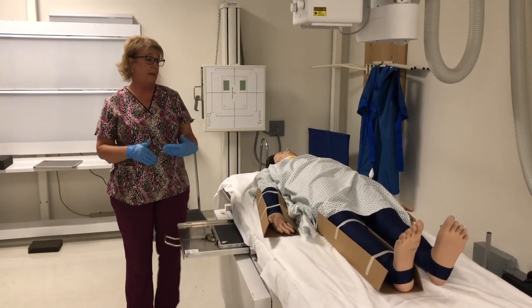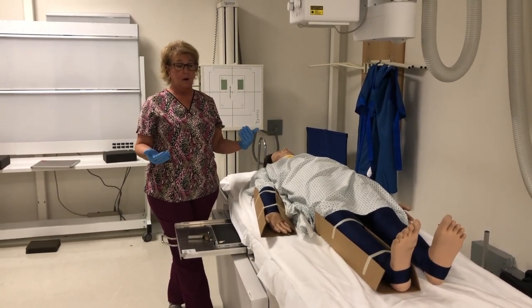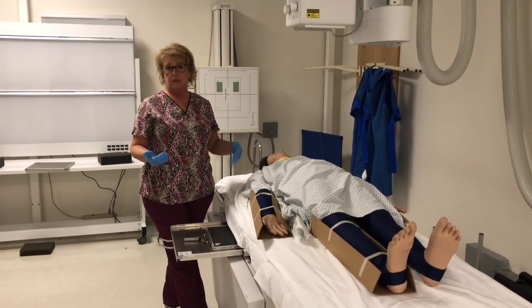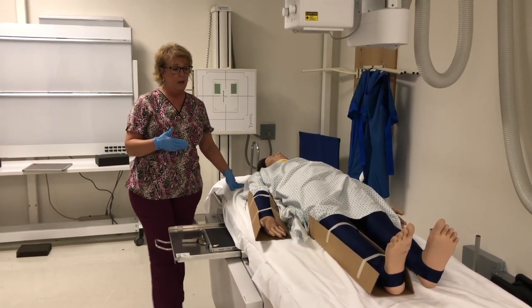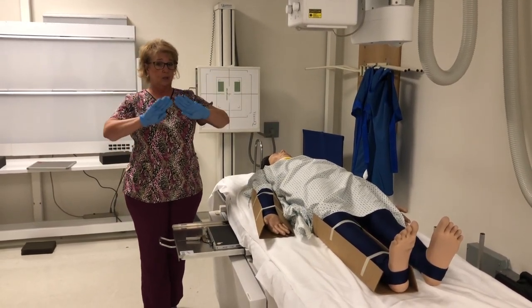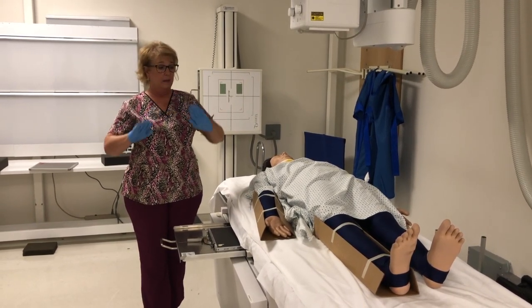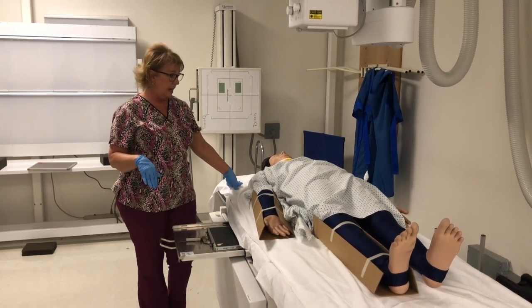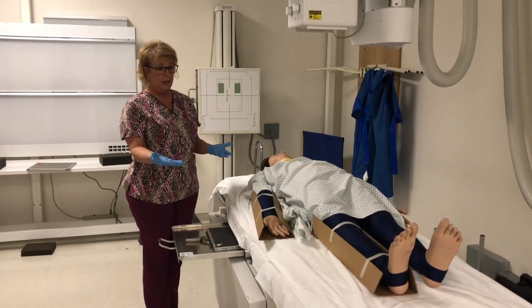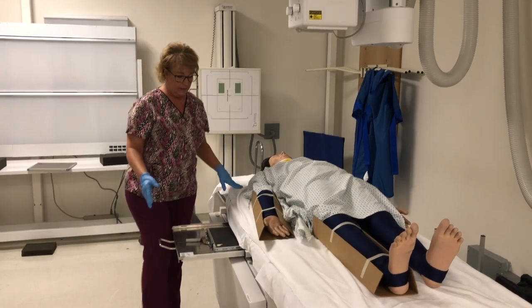Obviously, trauma can occur anywhere in the body, but extremities and spine are common, as well as chest and pelvis, but those don't really differ too much from what we've already talked about. The pelvis would be done as you learned it, except with no internal rotation of the legs if there was leg or hip trauma. So I'm not going to cover pelvis today, and I'm not going to cover chest, but we're going to talk about techniques to stabilize and safely move the limbs during a trauma exam.